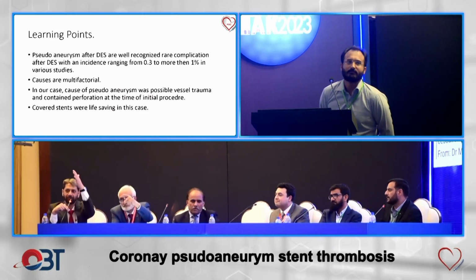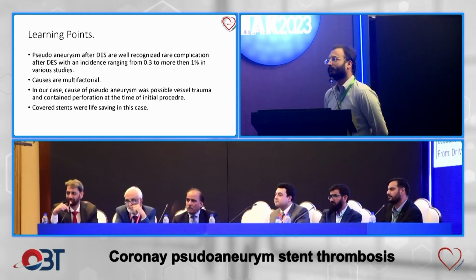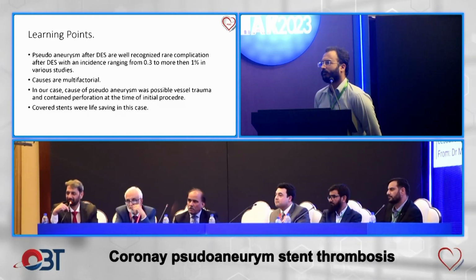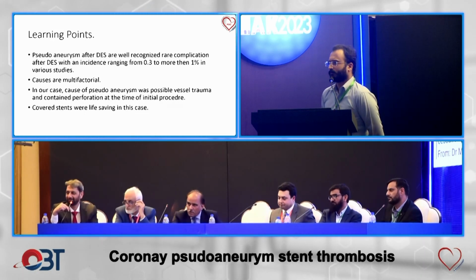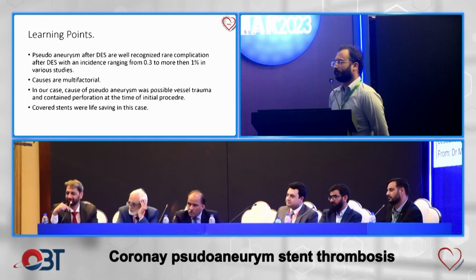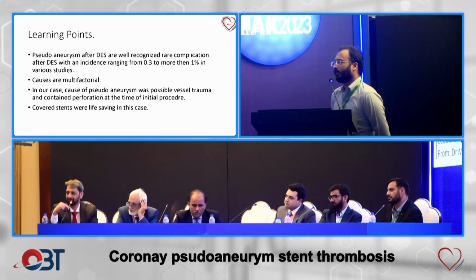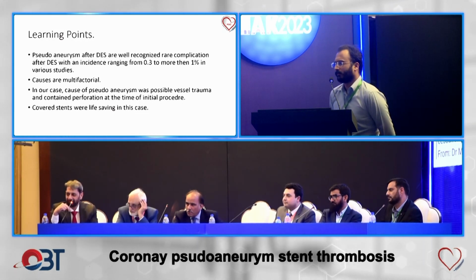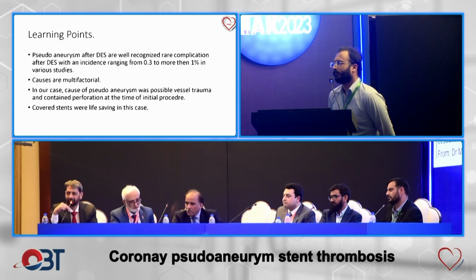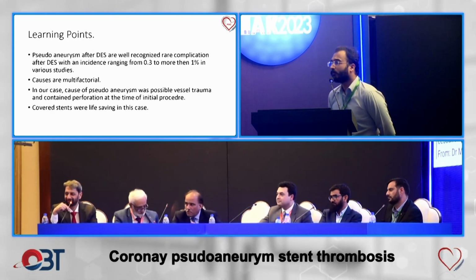One comment. After putting a covered stent, it's better to have a post-stent dilatation as well. Because sometimes leak is coming out from the sideway and you can't match it to the vessel wall. The deployment is not proper, so you can't seal it properly. So better to have NC dilatation. And if it is not an affordability issue, you can put a DES after having a covered stent.